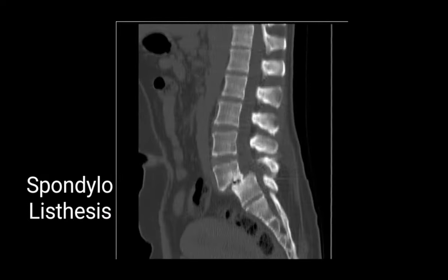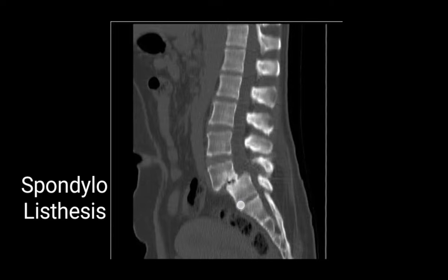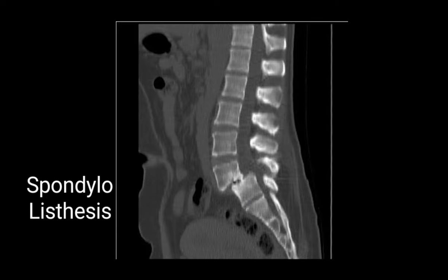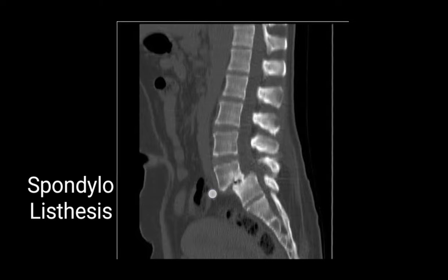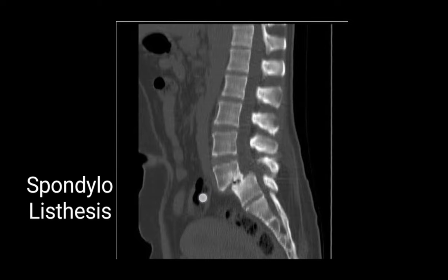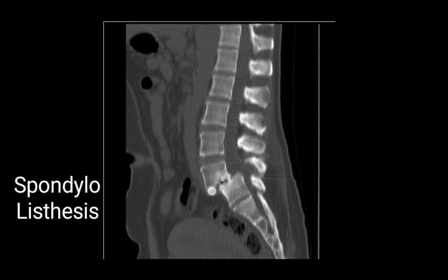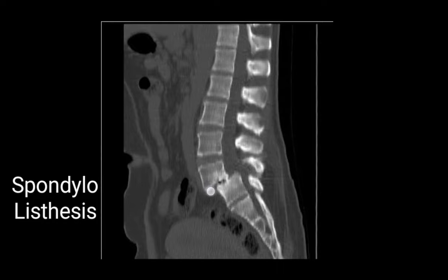This is an image of spondylolisthesis, where one vertebra has slipped over the other. In the image, this vertebra has slipped to the front — it should normally lie here but it has slipped forward.